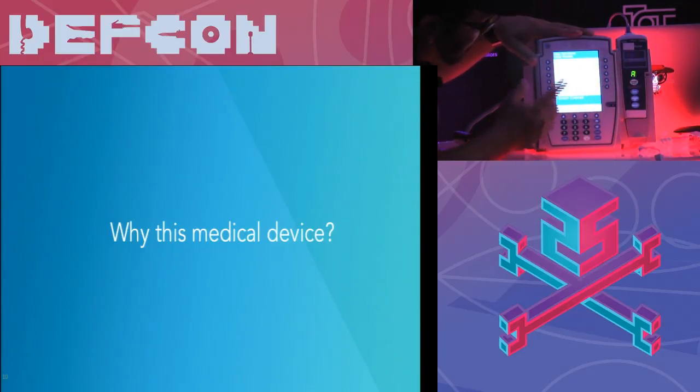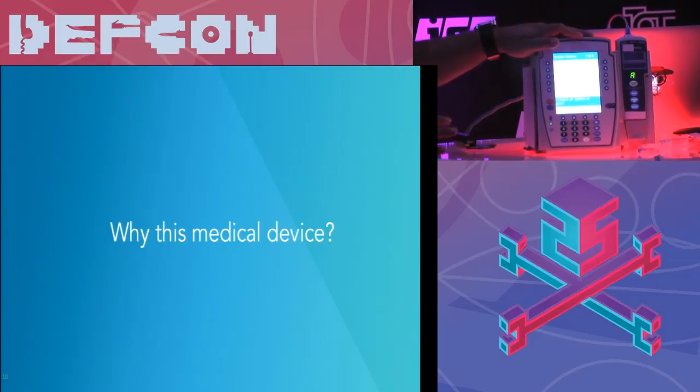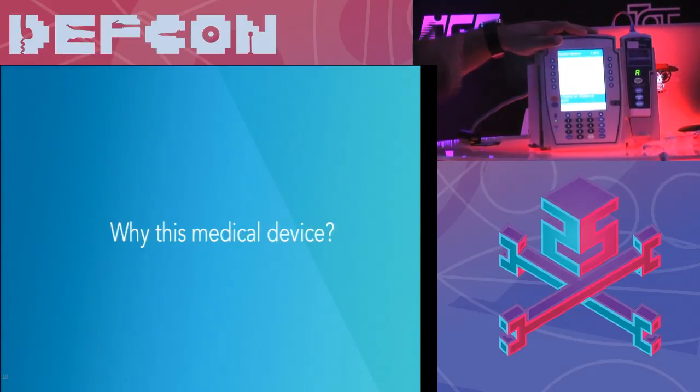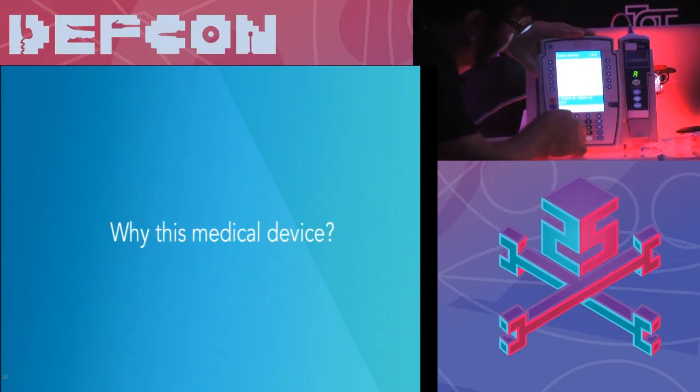It has some options here to go around and do some configurations, but it's really limited. You cannot change anything here. You need external software connected to the serial cable to make changes. For example, the Wi-Fi connection has a Wi-Fi card in the back, and that's something you need to configure through software. You cannot do it here. This is just read-only.